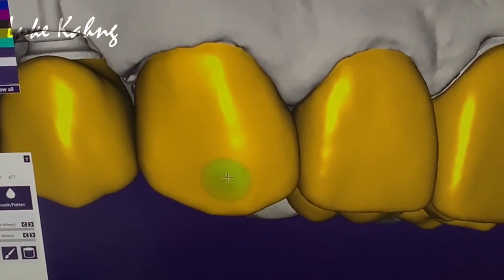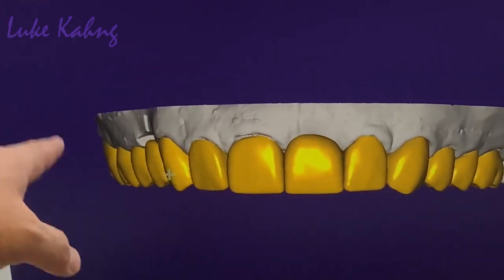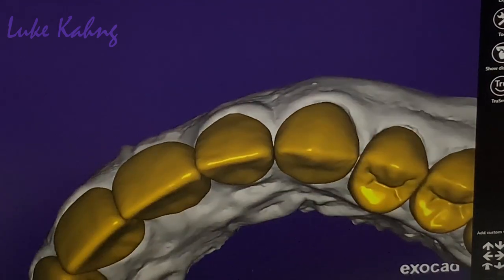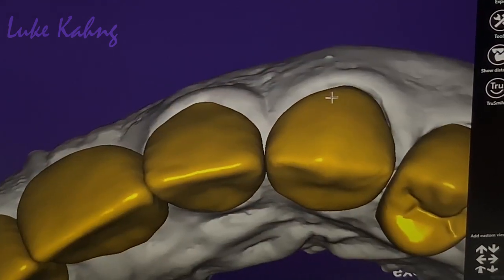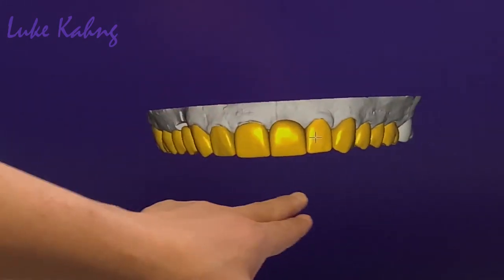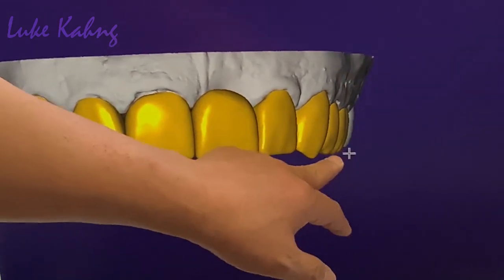Let me see the photo. Frontal view, much better. See, much better. I like this. Just cut it facial a little bit, bring it down. Okay, much better. Now, you see, always premolar, not longer than this. Not the same as this. This is better.